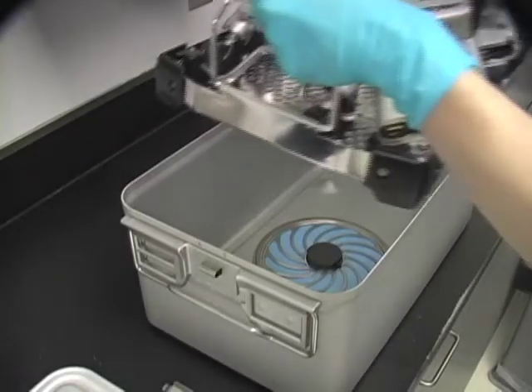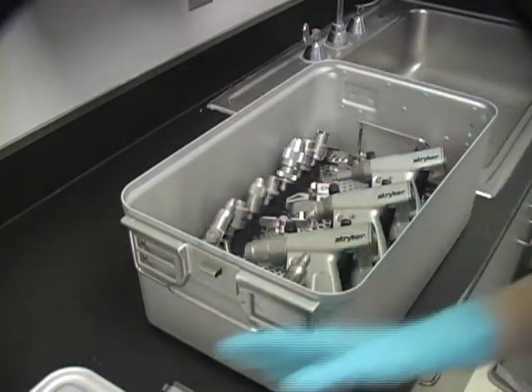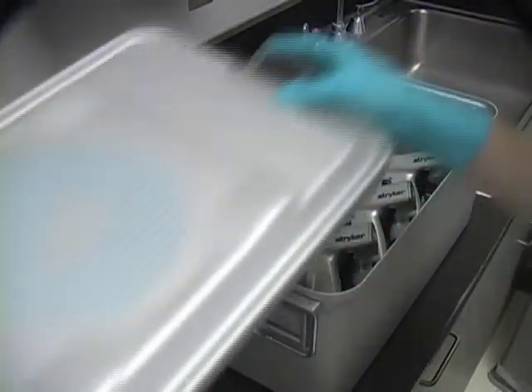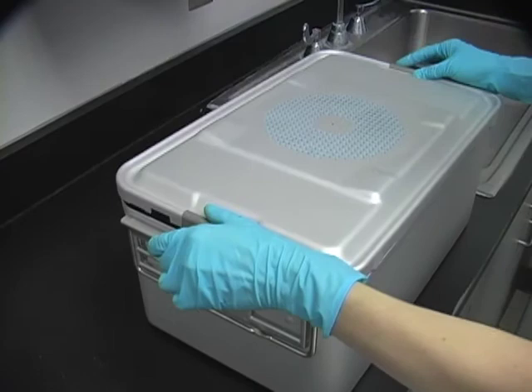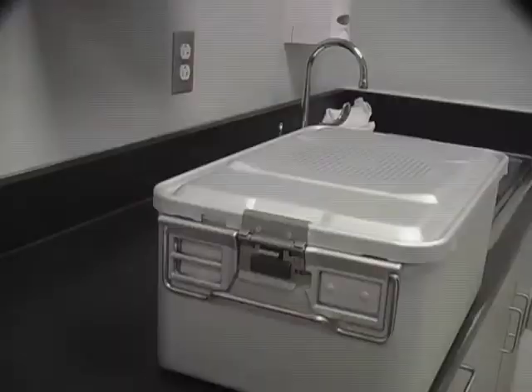Place the insert tray loaded with the dry medical devices into the prepared container bottom. Place the assembled lid onto the container bottom, aligning handles on bottom with latches on lid. Simultaneously close both locking latches onto the container lid.